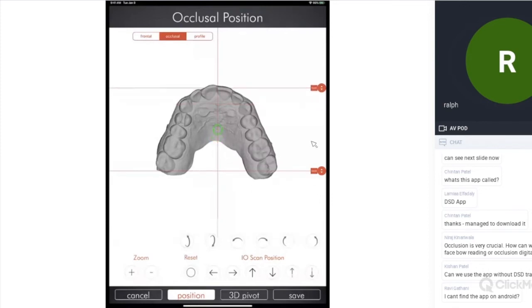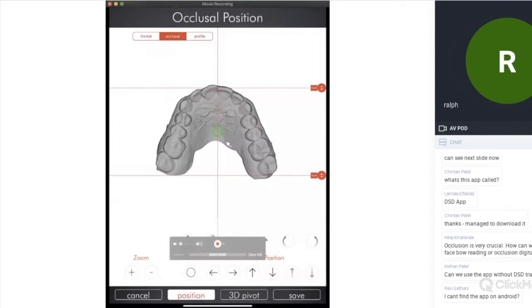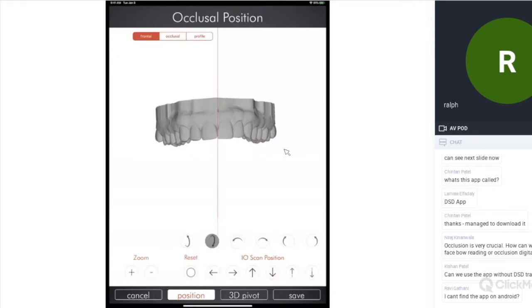Let me do the 3D smile design. So now that's my occlusal view. I see the palatal area. I can calibrate properly. And now let's take a look at my arch, my occlusal curve. Now we see why the smile frame was not set properly, right? Because we have issues here. We should start with ortho. But I was the worst patient ever. No ortho, perfect smile now. You know very well what I'm talking about, right? When the patient comes into the office and says, I want the smile now.